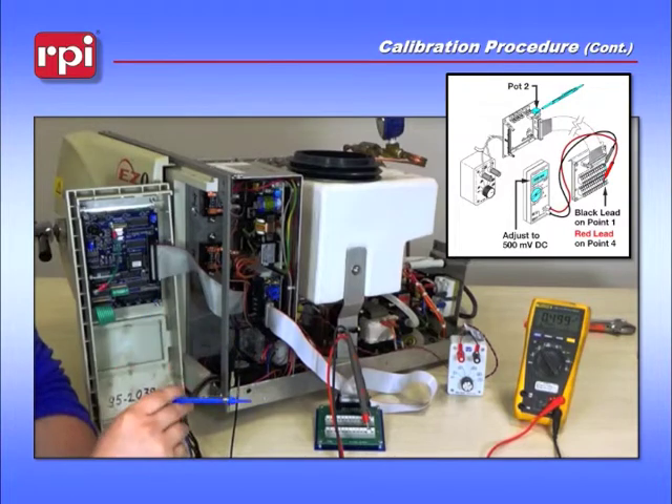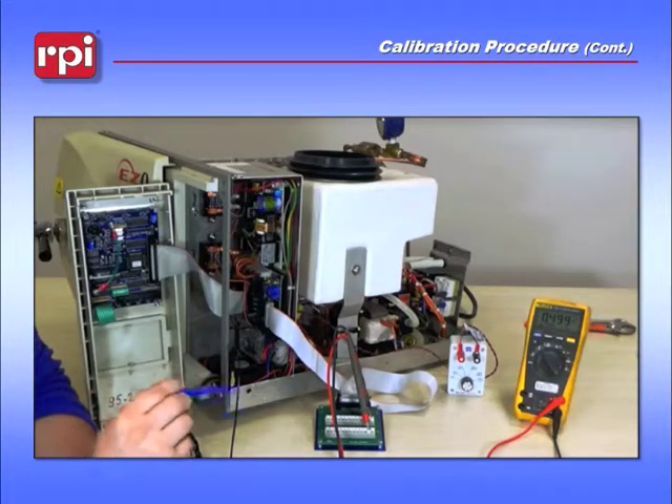This particular setting may be difficult to actually get to 500 millivolts, because it is also a trigger point for one of the chips on the Adjunct 3 board.